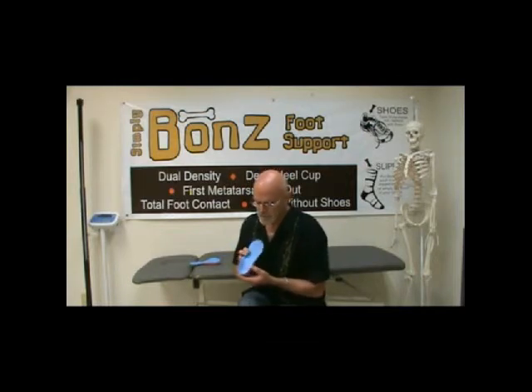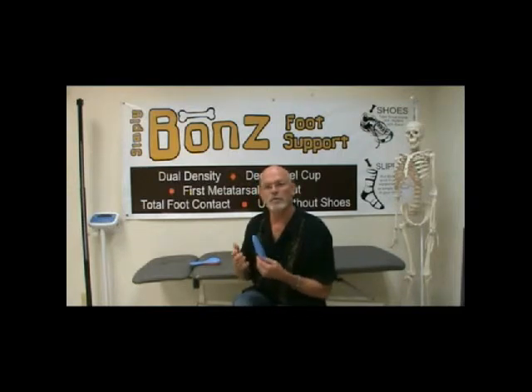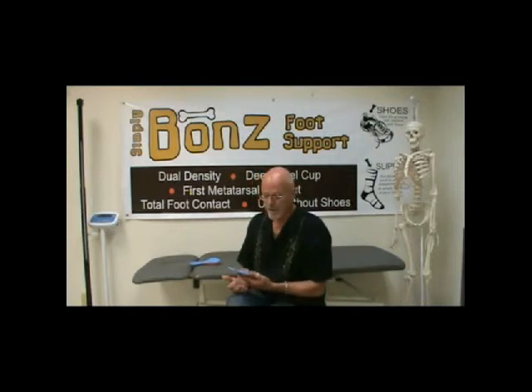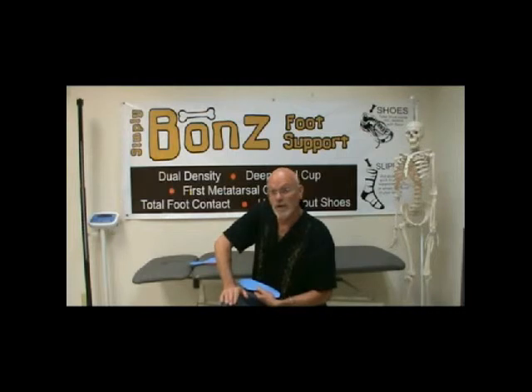The other issue with these is because they're so deep and wrapped up so high, then they provide what we call total contact or greater contact with the foot. And that has something to do with pressure. You see, pressure is force divided by area, okay? So all that means is that if I press on my leg using my whole hand with 2 pounds of force, well, that's not much pressure, okay?